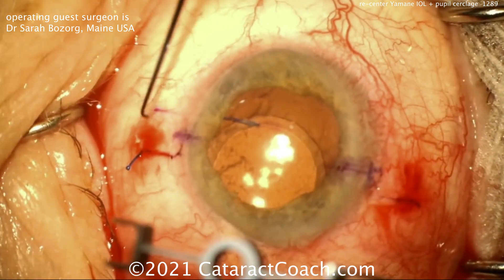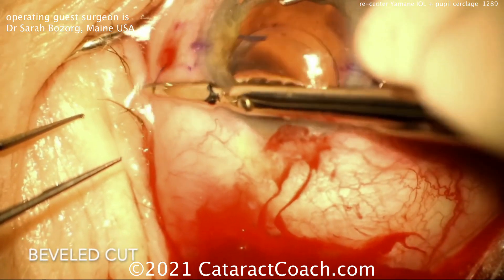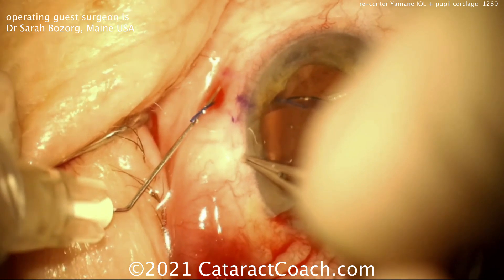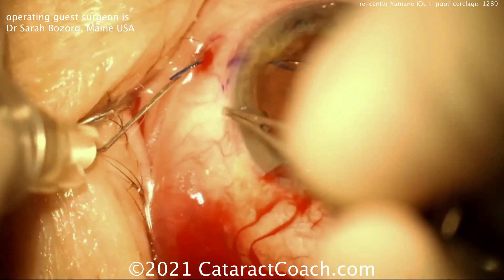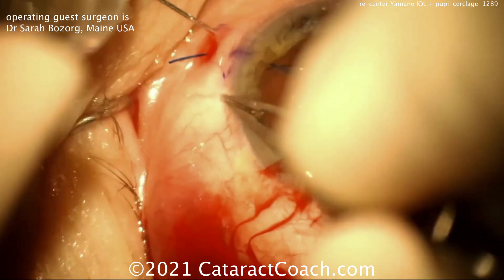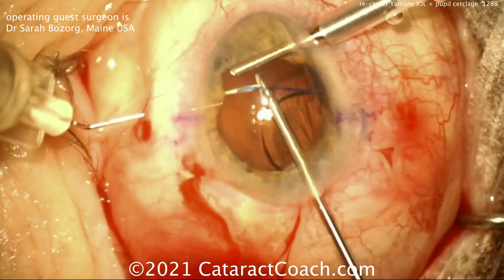Now she's using a special marker here to really get the two marks 180 degrees opposite. You can see she needs to move that haptic over, so she'll cut that bulb off the tip — that little flange — and she's going to make a new entry site using that 30-gauge TSK needle. This is a technique she learned from Steve Safran, who's a fantastic surgeon. It's important that you have these two haptics exactly 180 degrees apart in order to prevent decentration.